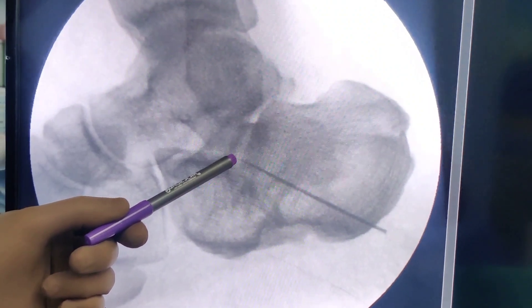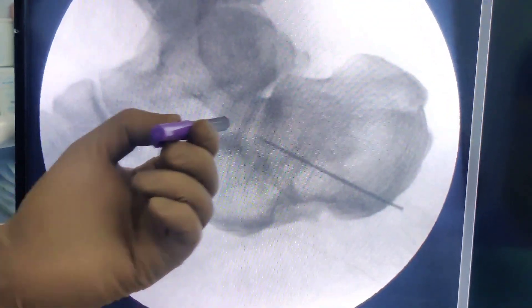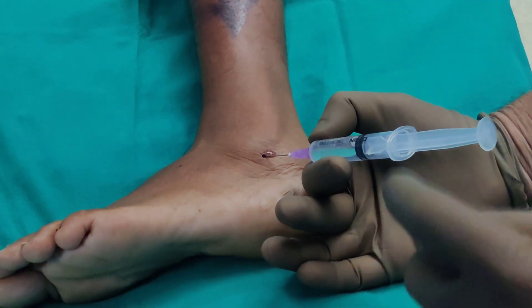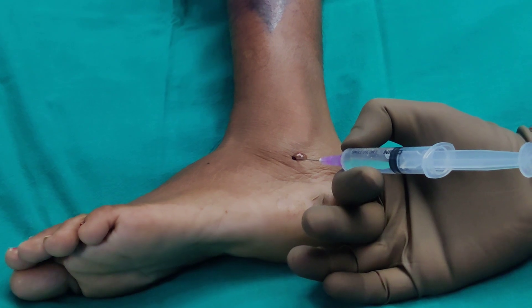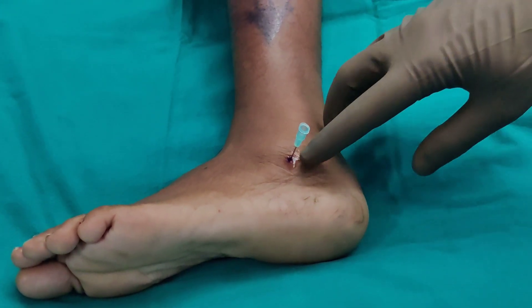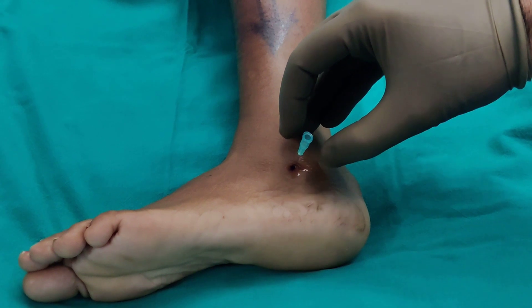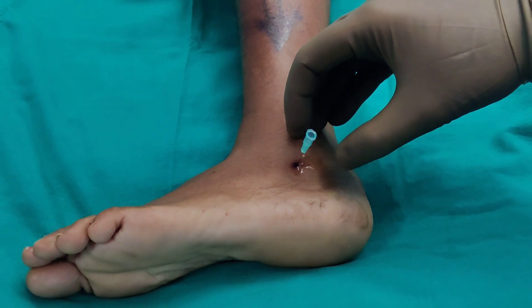The needle is just about in the right space. Once it is in this position, the next step is to make it vertical, then go inside and insert some Omnipaque. After identifying the position, I use a marking pen and then infiltrate some local anesthetic so that inserting the needle is as painless as possible for the patient. When starting out, it may take some time to negotiate into the subtalar joint, but when you reach the right place you will feel a giveaway sign as you enter the joint.